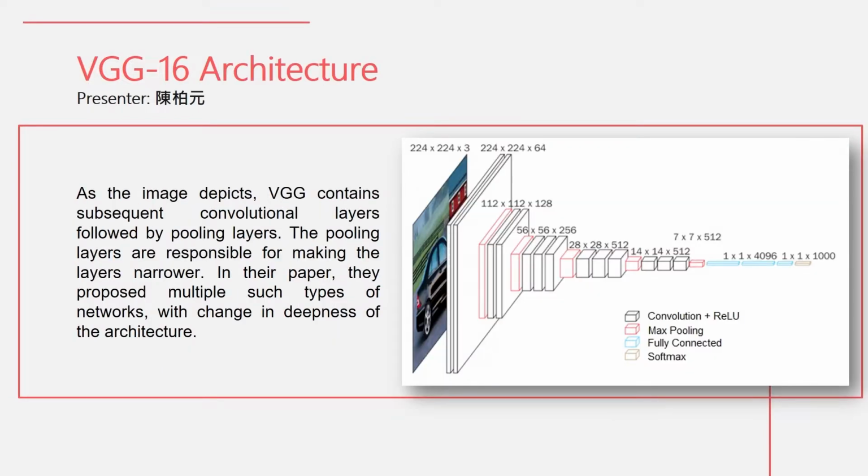And for the VGG16 architecture, first and foremost, compared to the large receptive fields in the first convolutional layer, this model proposed the use of very small 3x3 receptive field filters throughout the entire network with a stride of 1 pixel. Other networks use larger filters and larger strides.